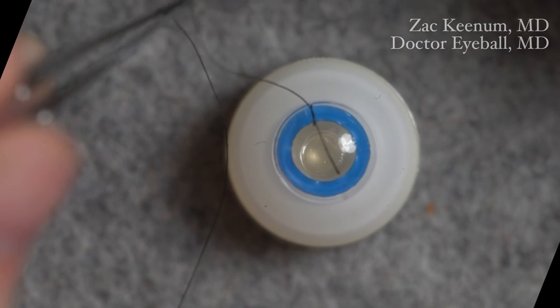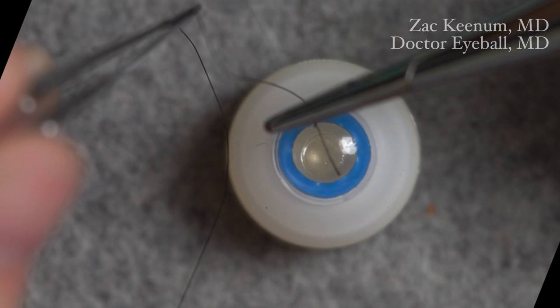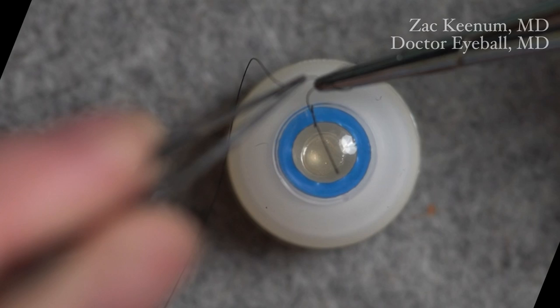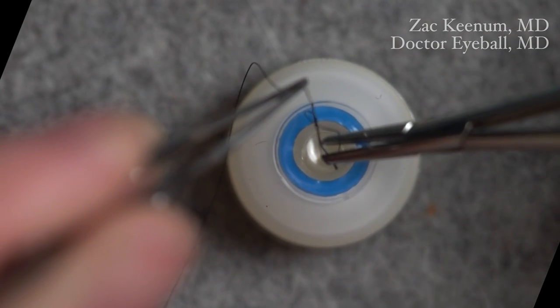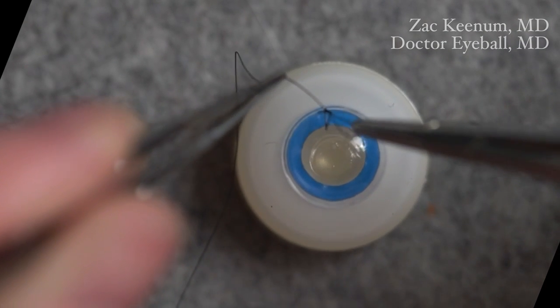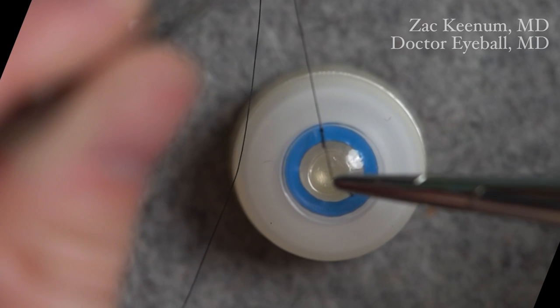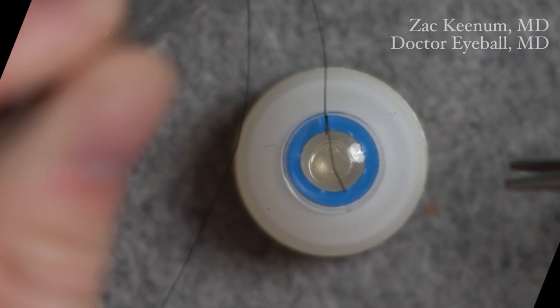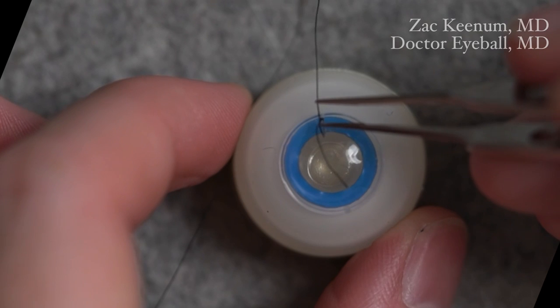Next, I don't let go with my left hand. I come from the outside — not the inside — but the outside on the back of that suture, go around and come underneath, then grab the short tail. The key here is to not cross. Keep that short tail on that side.